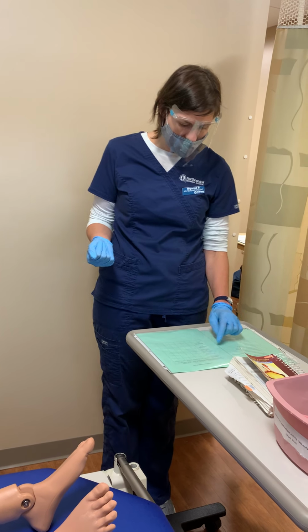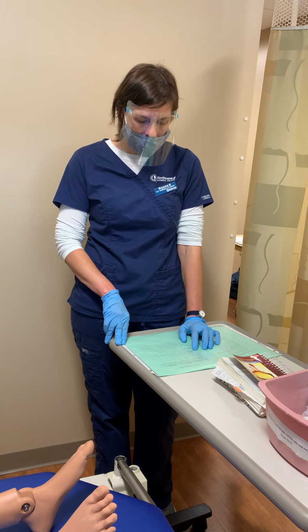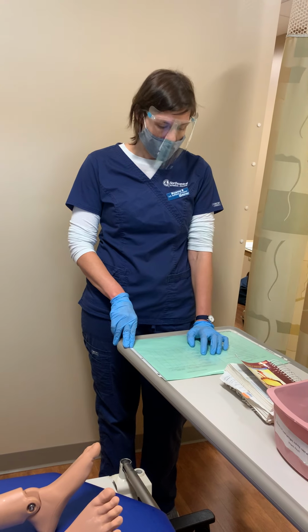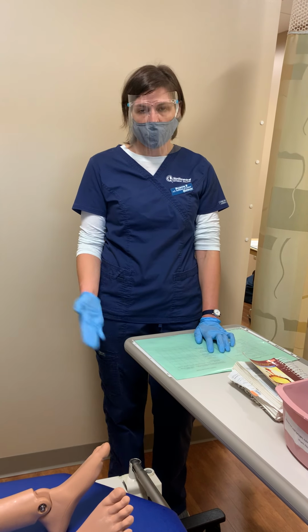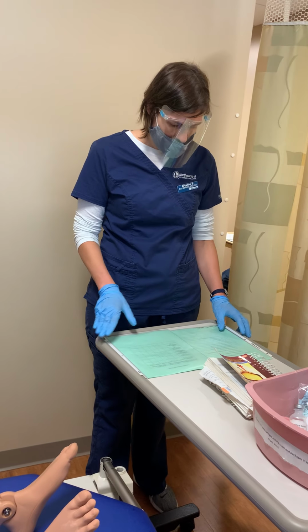And then for my morphine, I've already looked at that for the IV push in the book. It can be diluted, but it doesn't need to be, so I'm not going to dilute it. And I will push it over 4 to 5 minutes as recommended by the book. Of course, with the flush before and after the push.